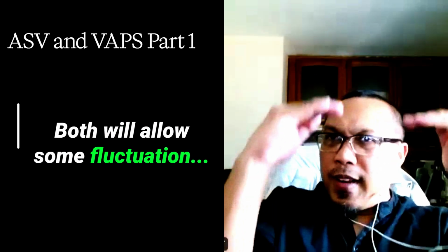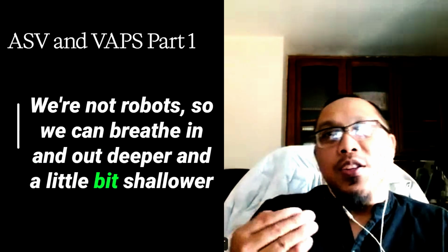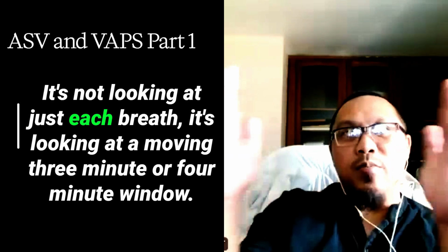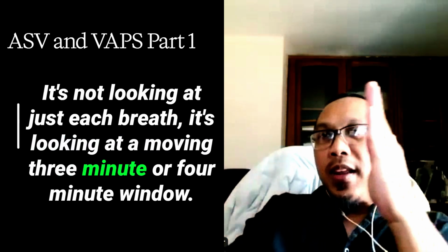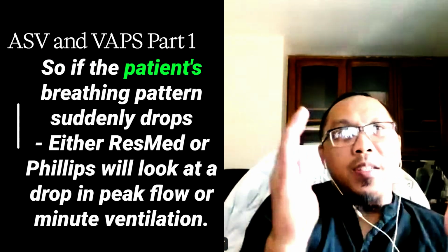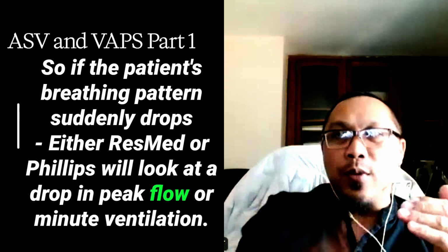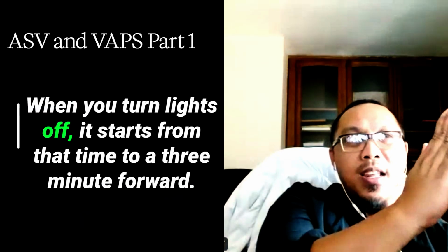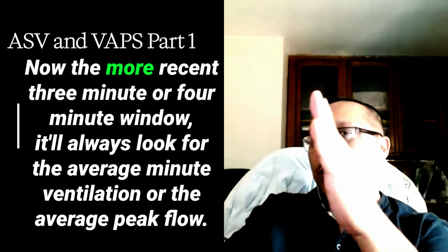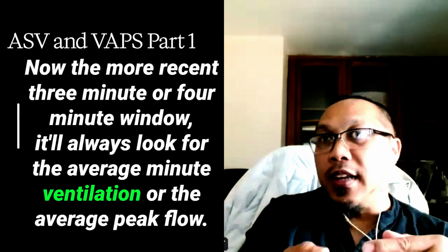Both will allow some fluctuation. We're not robots, so we can breathe in and out deeper, a little bit shallower sometimes, but then it will always average. It's not looking at just the breath, it's looking at a moving 3-minute or 4-minute window. It follows the patient's breathing pattern. So if the patient's breathing pattern suddenly drops, either ResMed or Philips will look at a drop in peak flow or minute ventilation. When you turn lights out, it starts from that time and goes 3 minutes forward. The more recent 3-minute or 4-minute window, it will always look for the average minute ventilation or the average peak flow.